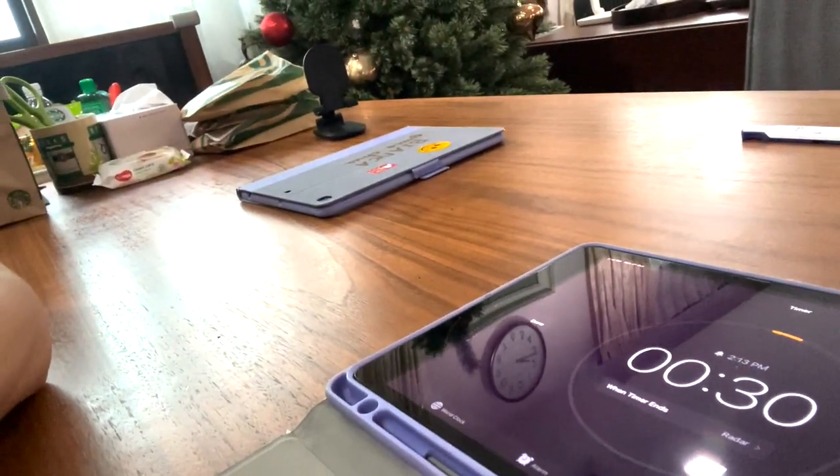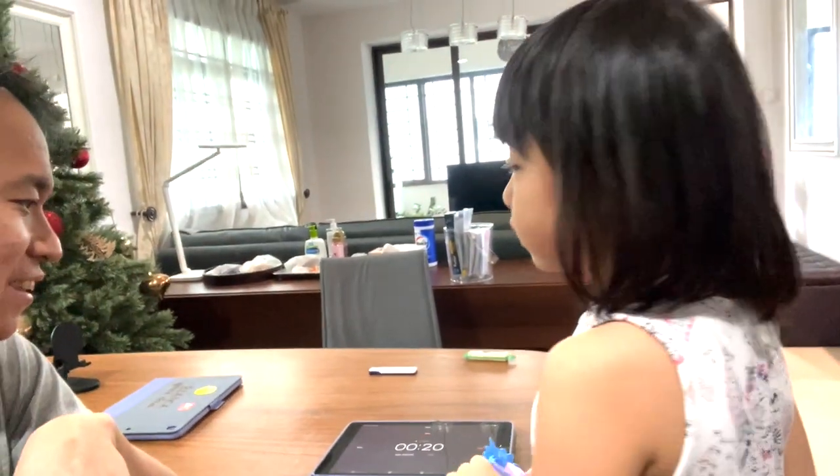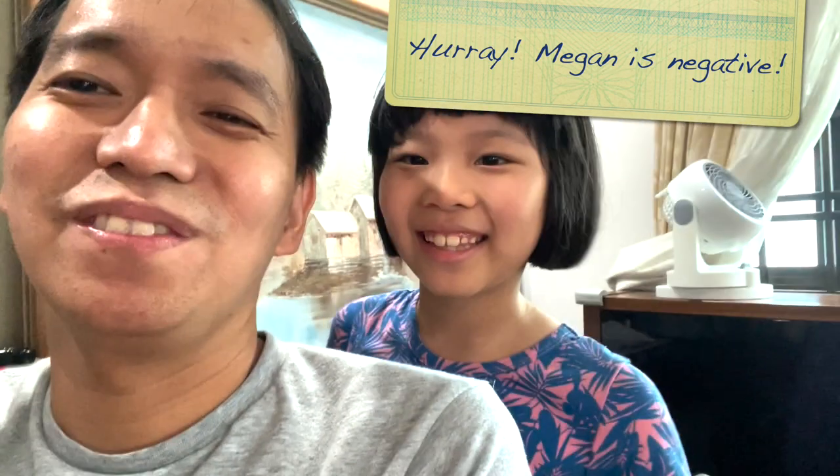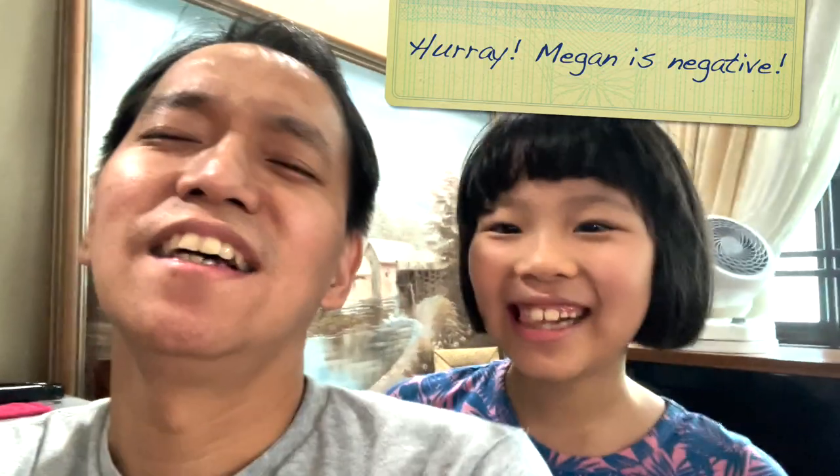Hello, I'm back and I'm here to check the timer on Megan's iPad. Megan's alarm says 31 seconds. Bianca, what does the yellow line mean? Yellow line means how much time is left. We're going to check Megan's result — she's reading a prayer book while waiting. Three, two, one — the timer rang. Let's check the results. Whew! Good job! Are we happy? Happy! Yes. Thank you, God. Thank you, Papa Jesus.